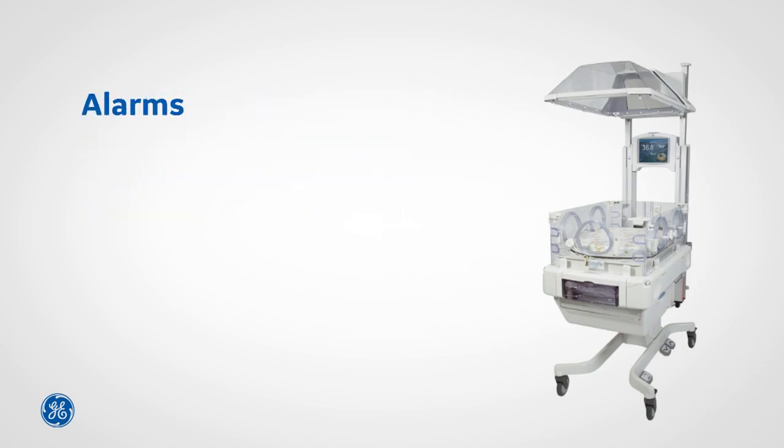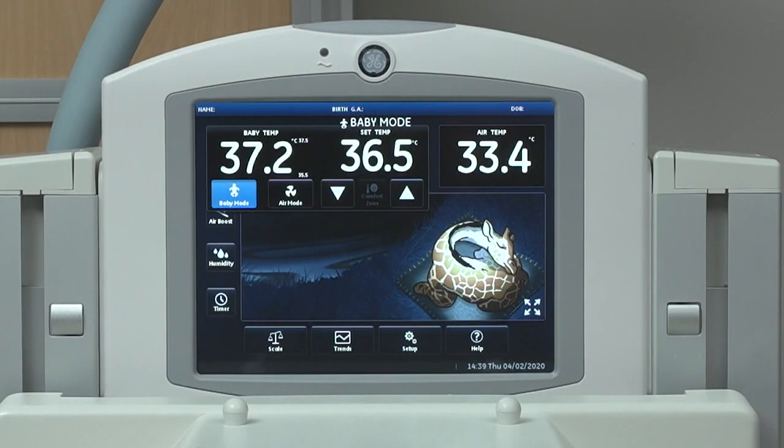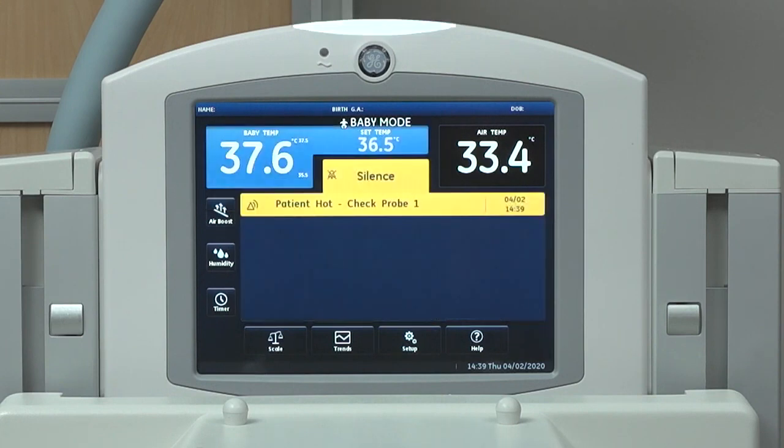Here are a few reminders about managing alarms on your beds. Do not stop alarms or decrease alarm volume without close monitoring of the patient. Read the alarm message on the center of the screen to understand what the alarm is for. Take care to ensure response and resolution of any alarms.